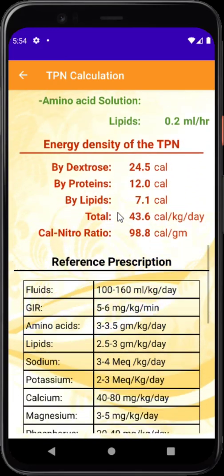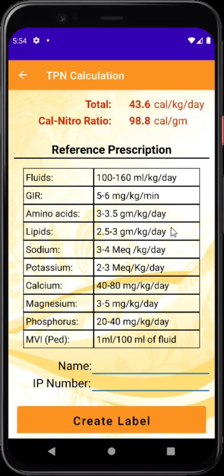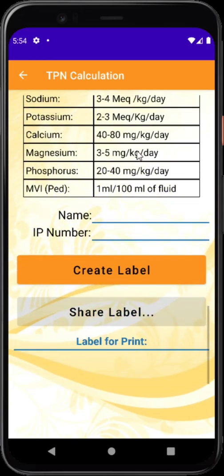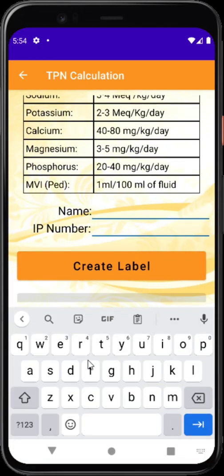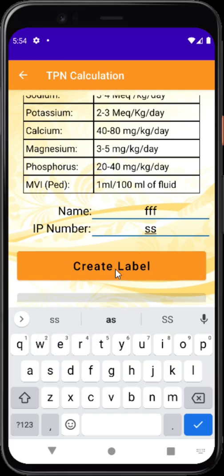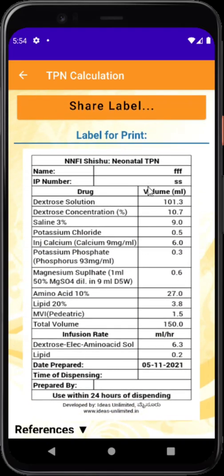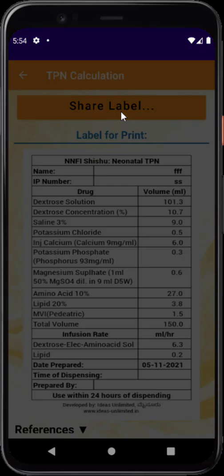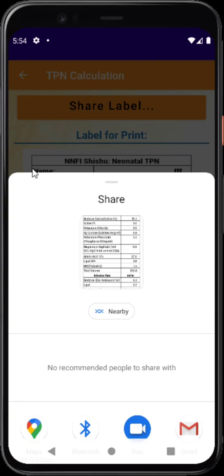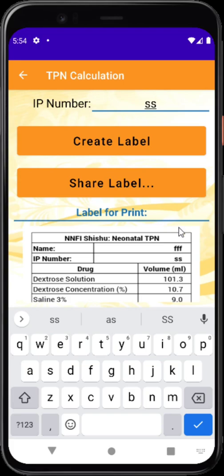The TPN calculator also provides a reference prescription for those beginning their neonatal career. You can enter the child's name and IP or MRN number, then tap 'create label' — this generates a label with all the calculated values that can be printed and shared via email, WhatsApp, or other platforms, and pasted on the case sheet or TPN bag.